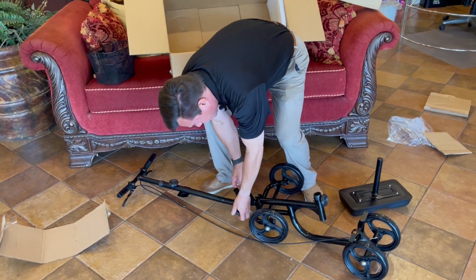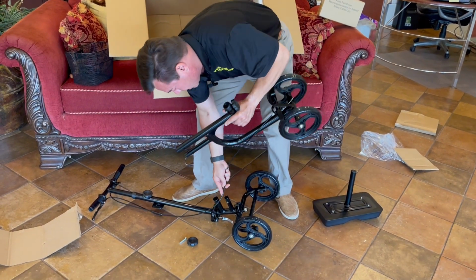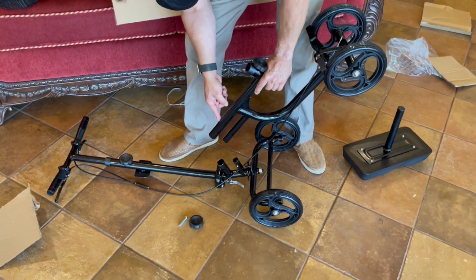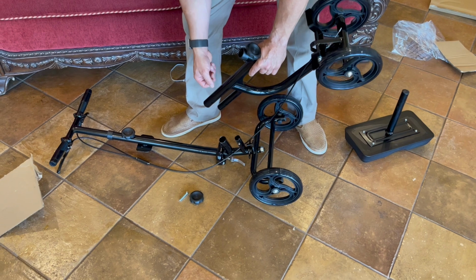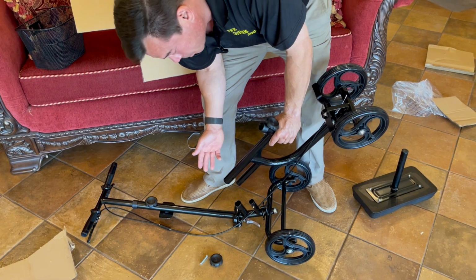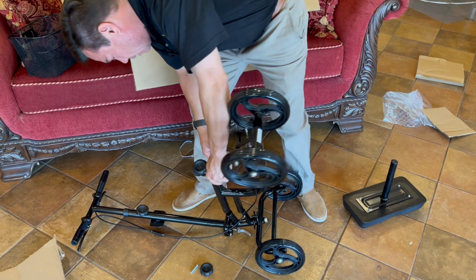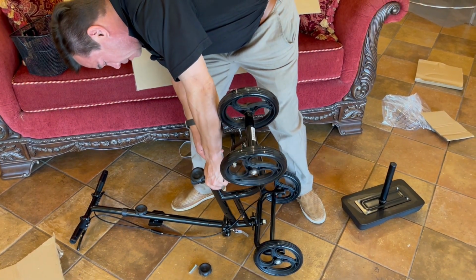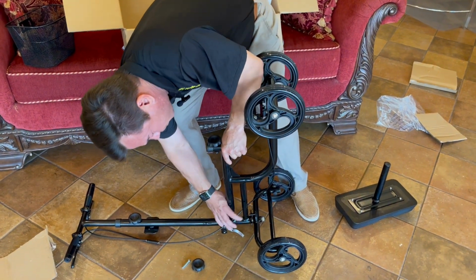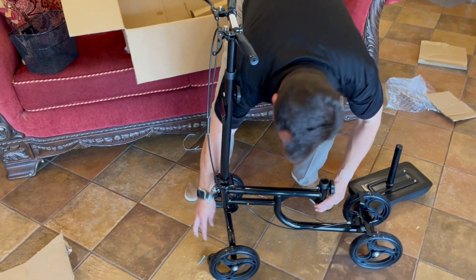At this point, we'll take this off, and then we take the brake line. I like to run it through these 2 parts of the chassis. The reason I do that, it keeps the line up off the ground. It doesn't necessarily say to do this. I found that's a nice little hack to actually make this work a little better. And then we pop this portion on to this right here. We pop the seemingly universal in all medical equipment pin until it pops out.